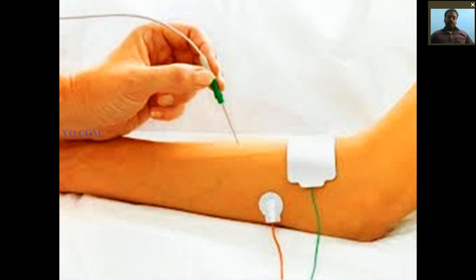In the previous class we studied the electrocardiograph, the measurement of heart performance. Today we are going to study EMG, which is used for the measurement of muscle activity. The main purpose here is to measure neural velocity. Okay, right. So let us see.